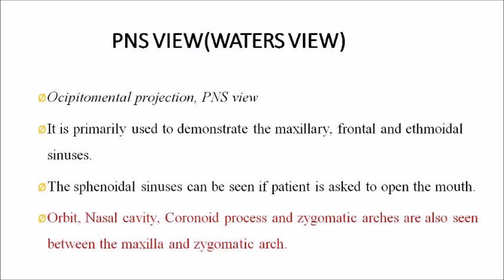The PNS view, also known as the Water's view or occipital mental projection, is primarily used to demonstrate the maxillary, frontal, and ethmoidal sinuses. The sphenoidal sinus can be seen if the patient is asked to open the mouth. The structures visible include the orbit, nasal cavity, coronoid process, and zygomatic arches.